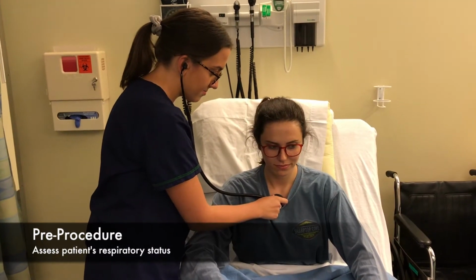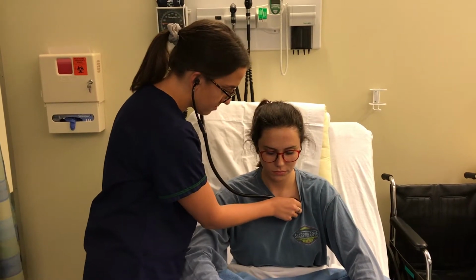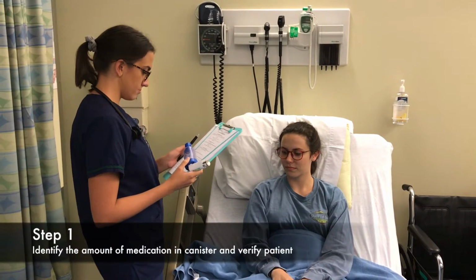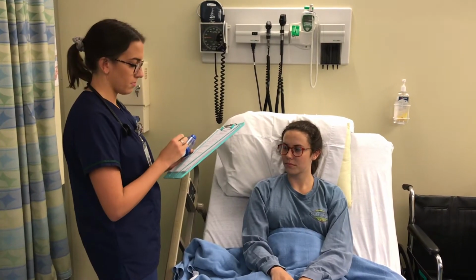It is important to assess the patient's respiratory status before administration of medication to establish a baseline that can be used to evaluate the effects of treatment. Identify the amount of medication for inhalation remaining in the canister, and be sure to check your patient's identification with their wristband.